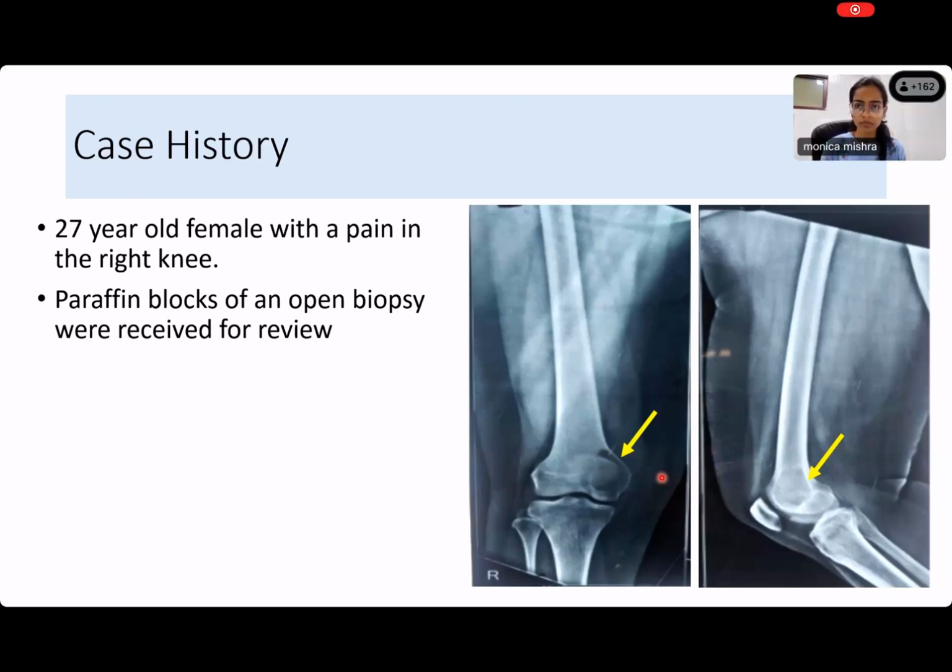So it is almost like a completely radiolucent lesion, and some people would look at it and say that this is a cyst because I can't see anything in it. Okay, but there are such things as cysts, yes, but anything that is not forming bone would look like this. So it doesn't have to be cystic. It's just some lesion that is there, either cystic or solid, but it is not forming bone. So it is allowing X-rays to go through this.